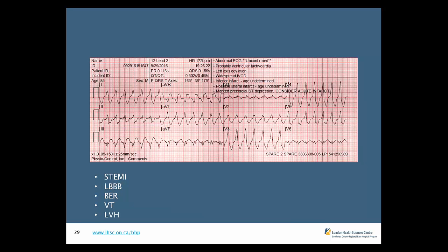Again, could the patient be having a STEMI? Absolutely, the patient could be having a STEMI in this situation. VTAC can occur in the setting of STEMI. However, based on this ECG, we don't have criteria to say that STEMI is occurring because this is actually ventricular tachycardia. And you look at the heart rate, 172. 85-year-olds cannot get their heart rate up to 172 unless something bad's going on. In this case, we have ventricular tachycardia occurring. So this patient would need to be transported to the closest emergency department for stabilization for our PCP colleagues and for our ACP colleagues. And of course, you can use your scope of practice to treat the patient in the pre-hospital setting.